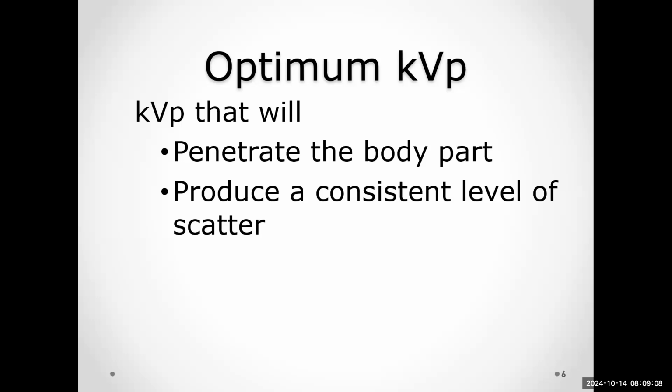But generally, we want to keep our kVp where it's producing a consistent level of scatter, a level that radiologists are used to seeing with whatever body part we're doing.